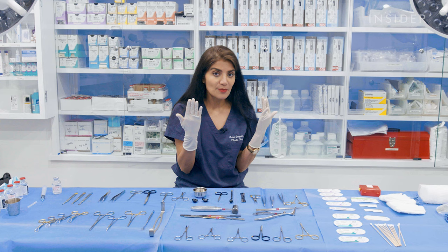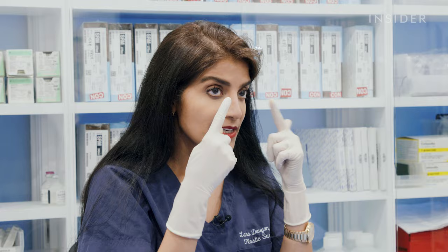In some situations, rasping the nose is not enough to give someone the contour they desire. We sometimes need to infracture the nasal bones and reduce the size of the nasal bones by breaking them. And that's called performing an osteotomy. How do we do that? We use a mallet and an osteotome.